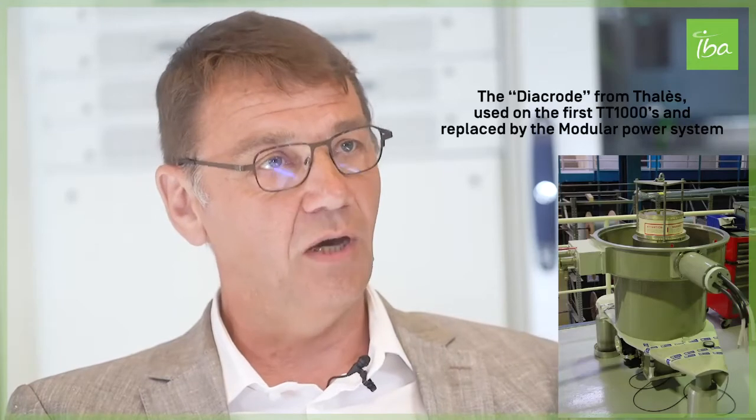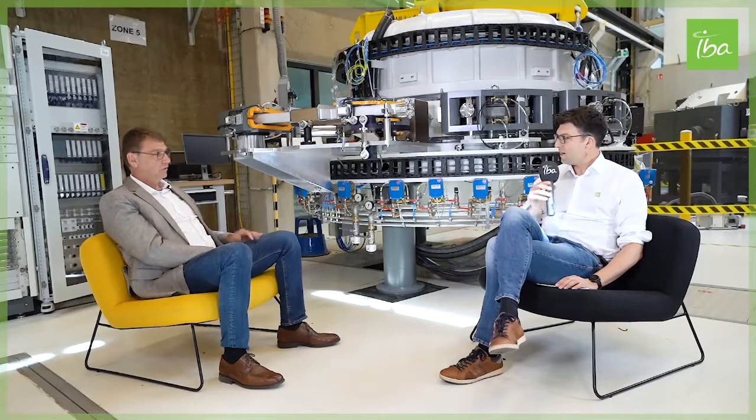But Michel, how did you come to this idea? What actually pushed you to innovate on this TT1000? The main goal was to get rid of the expensive and, let's say, difficult to procure diacrode from Thales. So here we are really on standard components that we are used to buying, installing and tuning. It's really a big advantage. I remember that diacrode was that 1 megawatt tube, which actually is a good tube, because it's very robust. But it was complex and an expensive spare part, right? Yes, and we are not sure about the supply of this tube in the future. So we wanted to get rid of that.